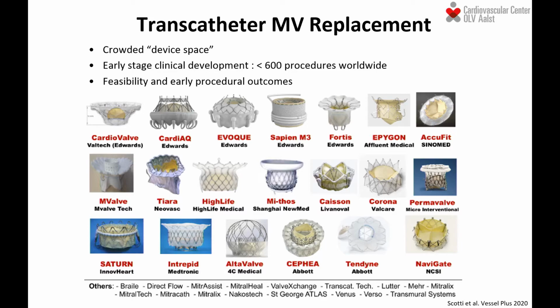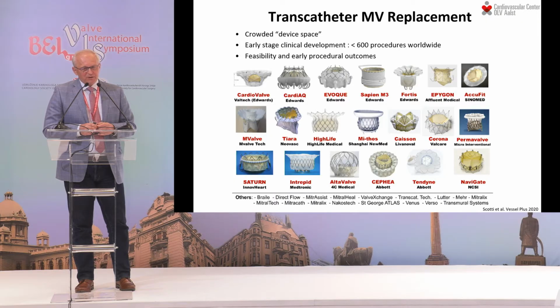And with this you also enter the consideration: can we do it differently? Can we use valve replacement? And this is actually a new era that started a few years ago. It's a very crowded device space, but it's still in the very early stage of clinical development. As far as I understand, there are no more than 600 cases worldwide done using the percutaneous valve. And basically this experience points at the feasibility and early procedural outcomes.